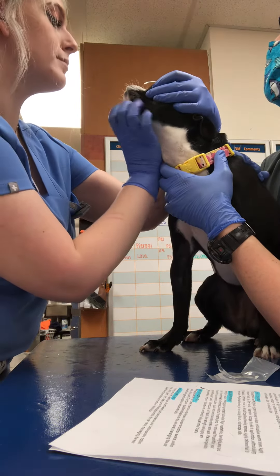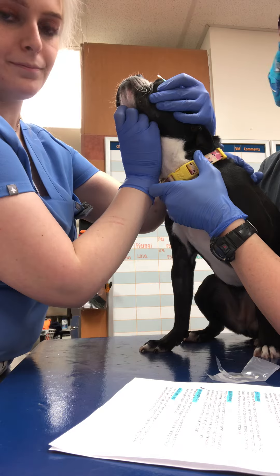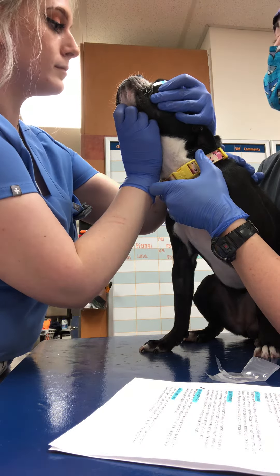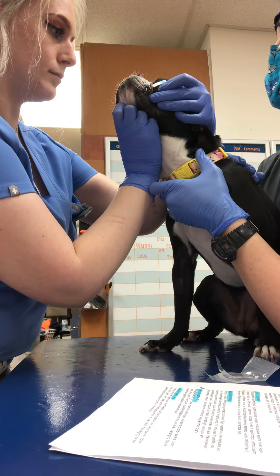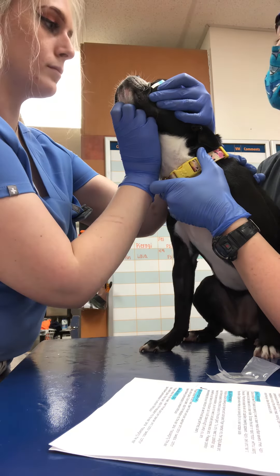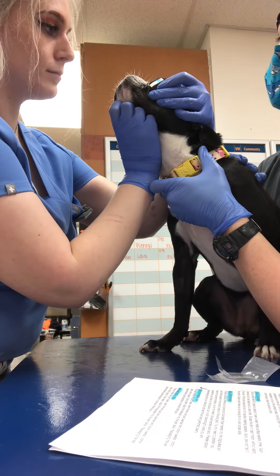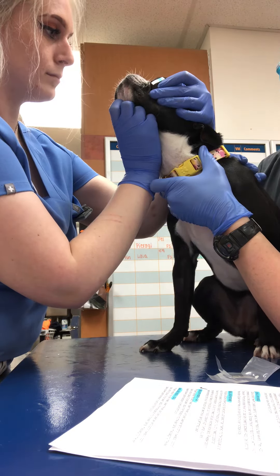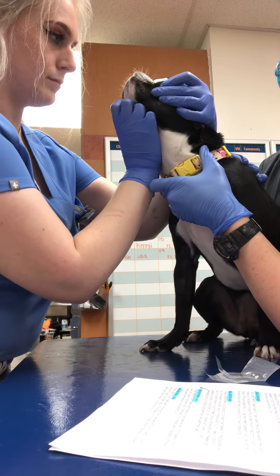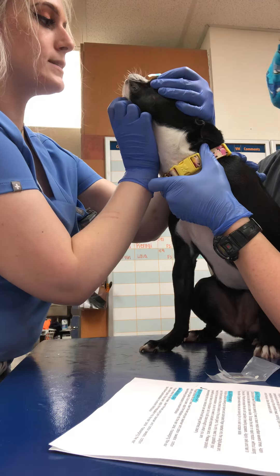Good girl, stay. We have about 10 seconds left.